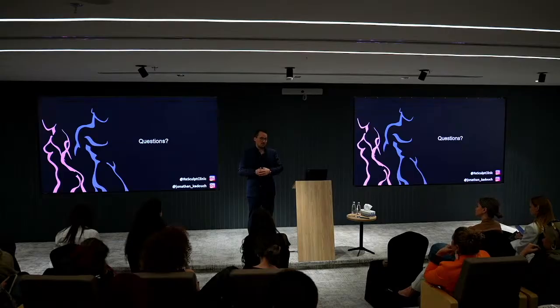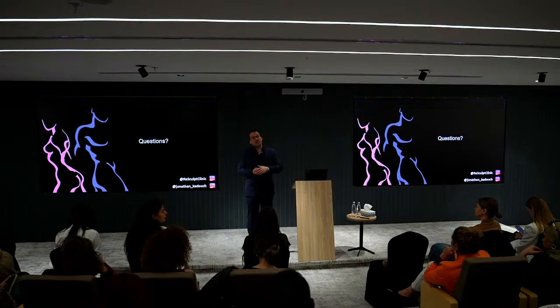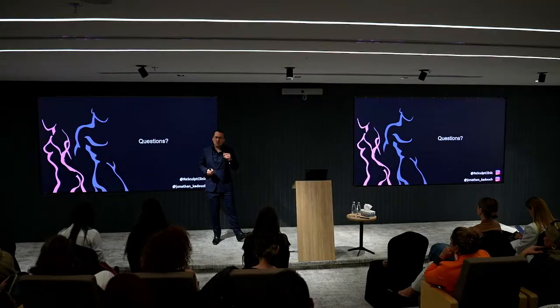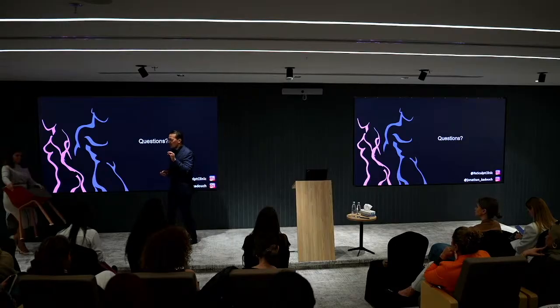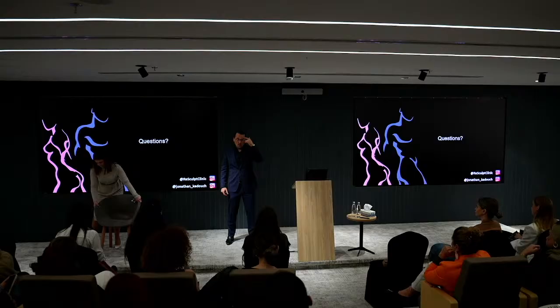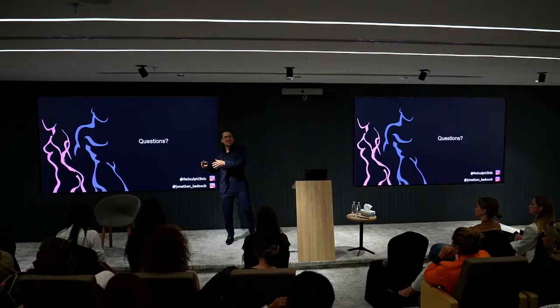For the forehead, do you think intense will be good, because you know it's a little bit strong? Yes, and that's why I think enhance is the best. It will still give volumization, lifting, integration, and of course the forehead is a tricky area. It's difficult to treat the forehead, but I think the moment that you have the right entry point, technically it looks more difficult than it is.